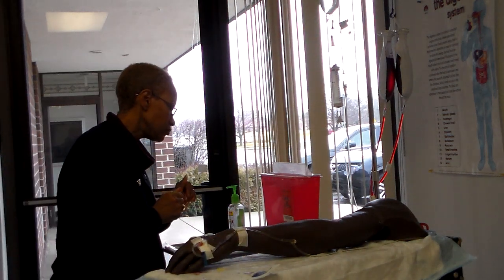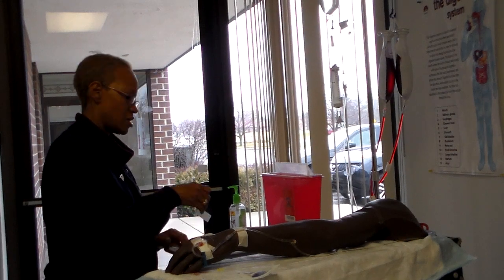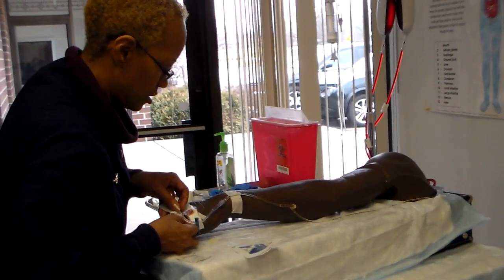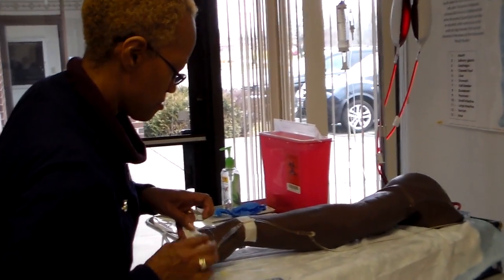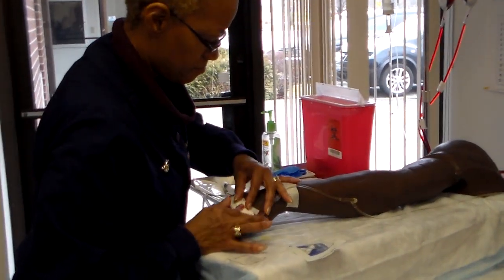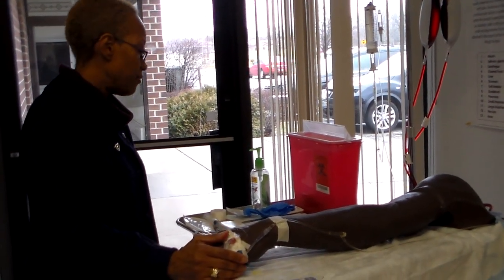Okay? And then I have my date and time tape already done. Let's see if I can stick it underneath here. You can put it on the side. And the size of my angio and my initials.